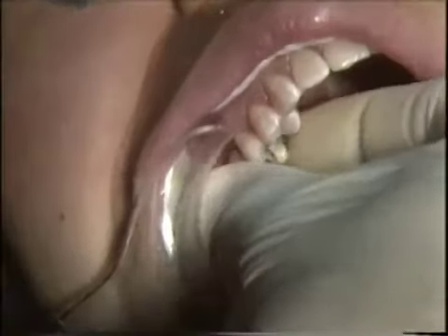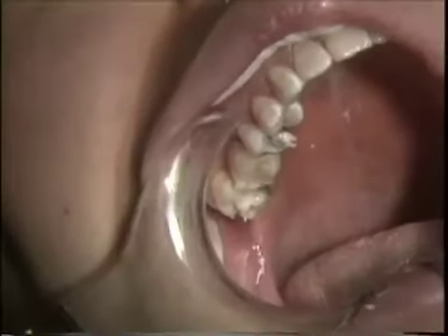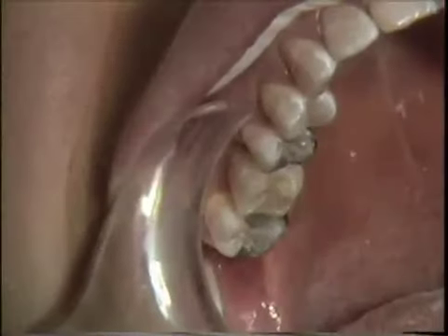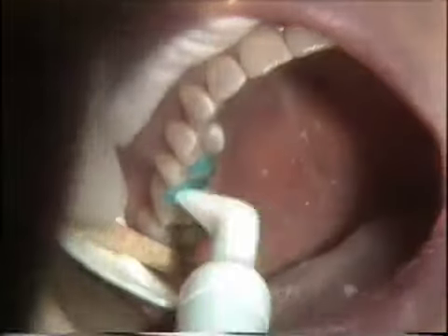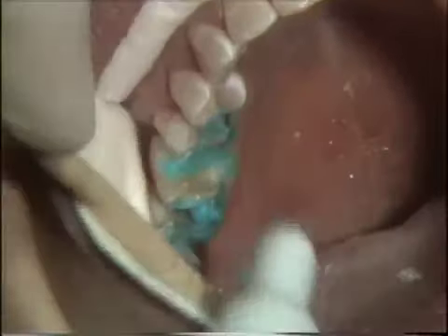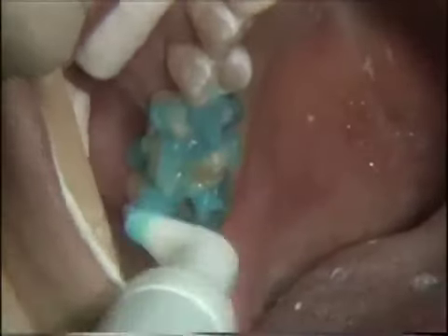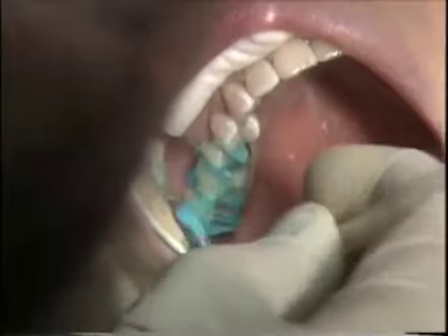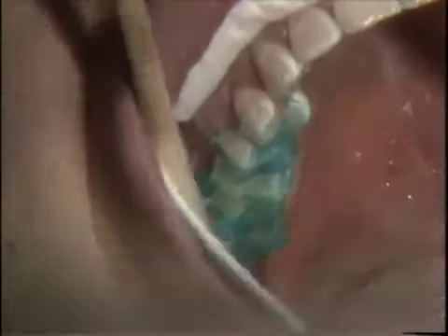We will bring the bridge into place. We have a little bit of working time because for the most part this cement is oxygen inhibited. We'll take a cotton swab and clean off a lot of the excess, then bring it down farther with an orange wood stick. We'll inject the OxyGuard — the wax — on these surfaces to keep oxygen and air off. We'll run it also in the interproximal because there are finishing lines there, and on the mesial, making sure we get it on the distal. You can also use a brush to make sure this is placed in the proper places. Then we'll have the patient close with a little bit of pressure to make sure the bridge is seated all the way.